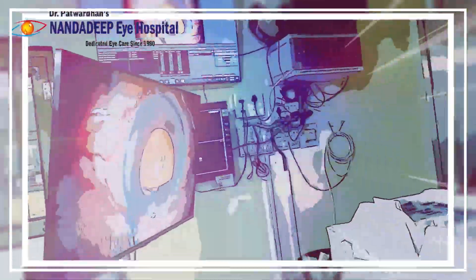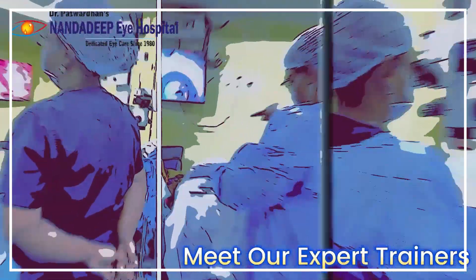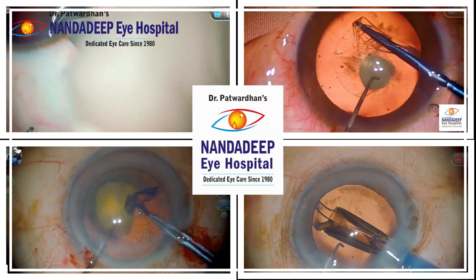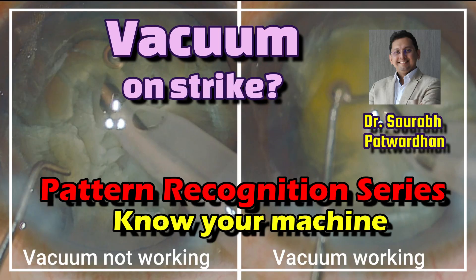Welcome to Nandadeep Eye Hospital, a Center for Surgical Excellence where we also train many colleagues in ophthalmic surgery. In this video I am going to show how to recognize that vacuum is not working as we expect. This is one of the videos from the pattern recognition series.